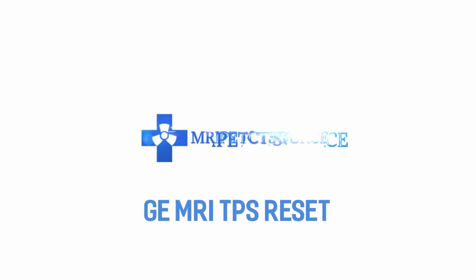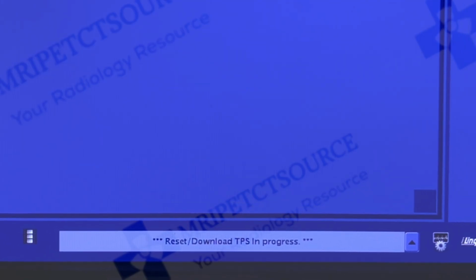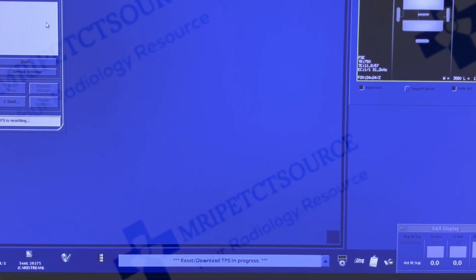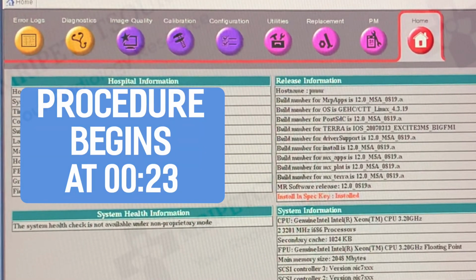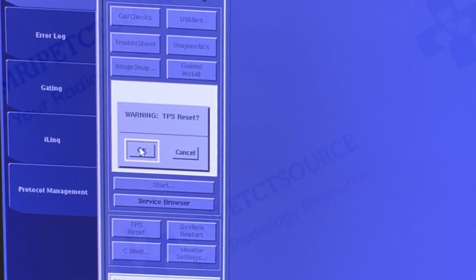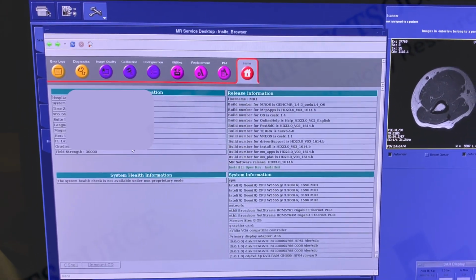This video details the GE MRI TPS reset procedure. There are two different methods to reset the TPS subsystem. The first TPS reset is performed through the service browser, and the second method is generally used once the MRI has booted to applications and the service browser no longer populates. This video will cover the first TPS reset procedure, so let's get started.